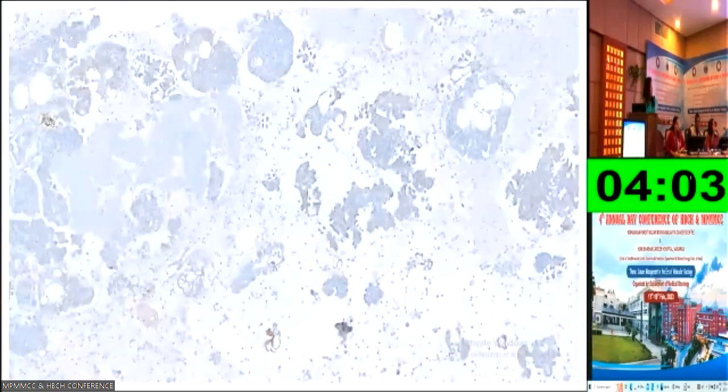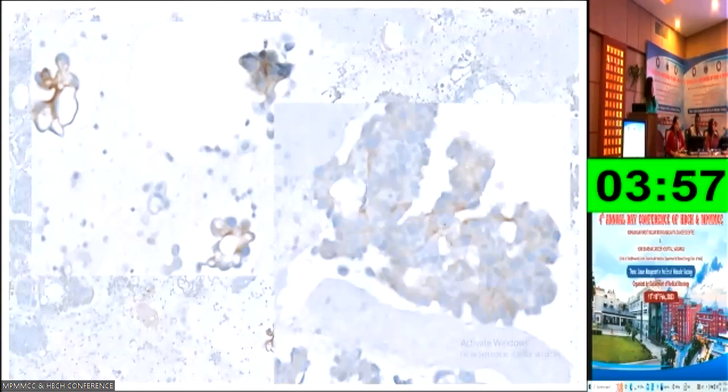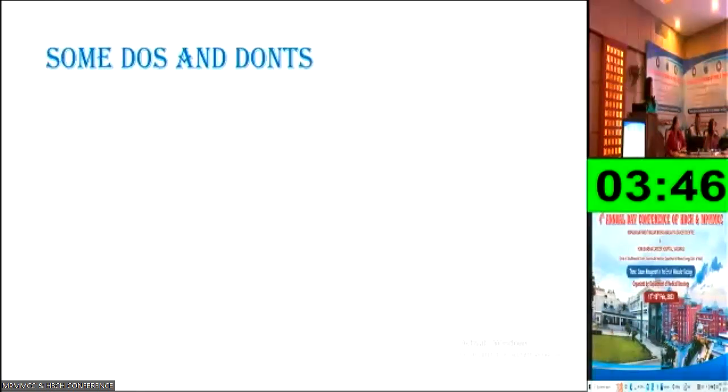So you can see a lot of staining, but tumor cells' membranous staining is considered. So it is one of the heterogeneous kind of biomarker. So entire thing is negative, very scanty. Though patchy heterogeneous is common, you have to take the entire picture into account. So this is a strong intensity, moderate, any intensity is fine. Necrosis can show, but this is not counting. You have to count in the tumor cells. This is all the cytoplasmic staining which you have to neglect. This is the immune cell staining, neglect.